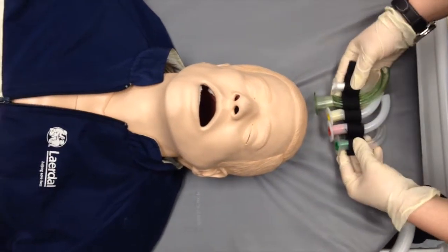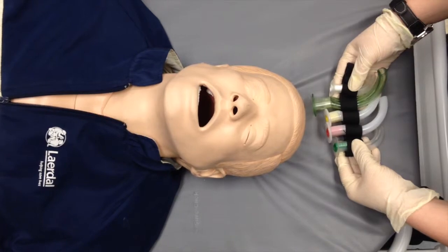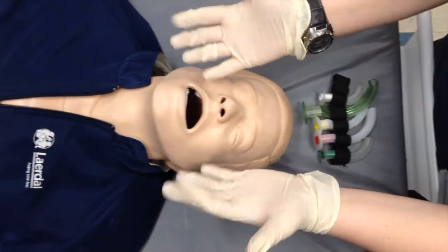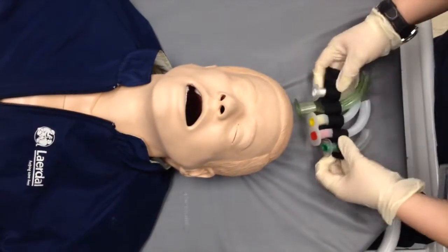This is an instructional video on the insertion of an oropharyngeal airway. Ensure the appropriate personal protective equipment is employed, including gloves, masks, and goggles.